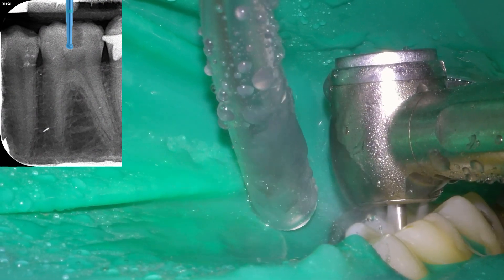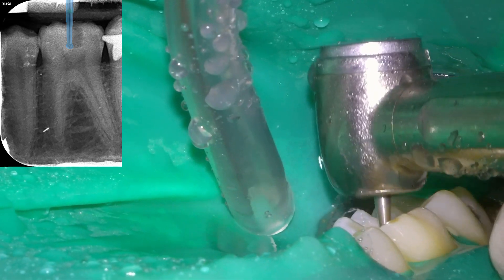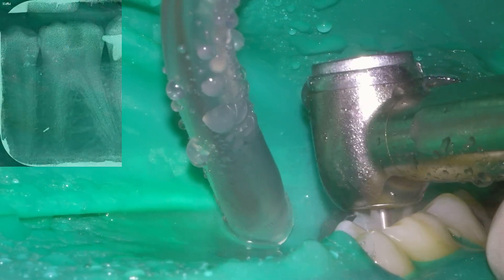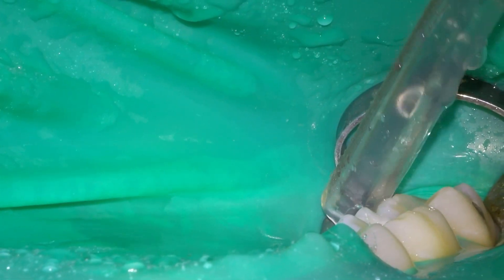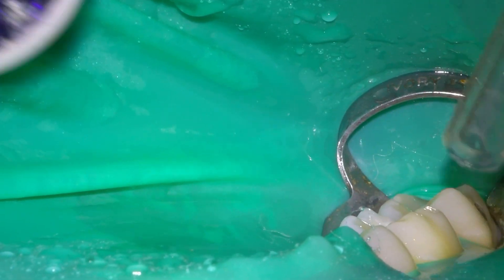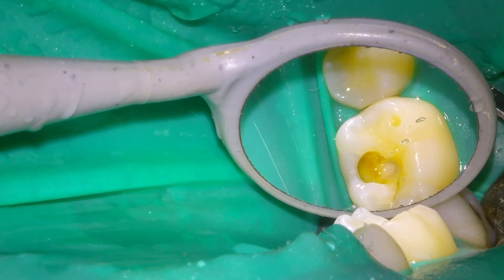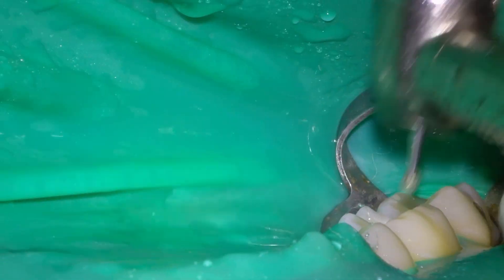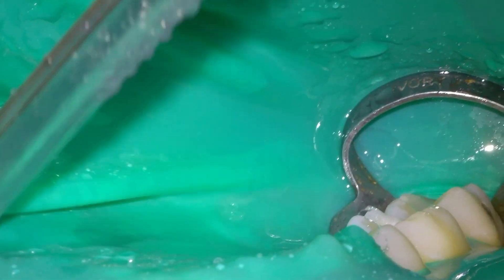We seek to notice that sensation of falling to the chamber. But it's not always like this. In young molars we usually notice that sensation, but not in atretic pulp chambers. That is why it is important to stop and inspect with the DG16 probe.